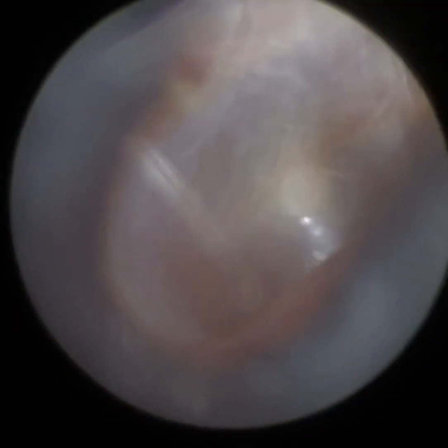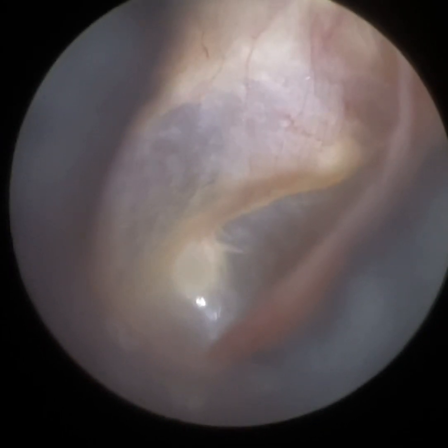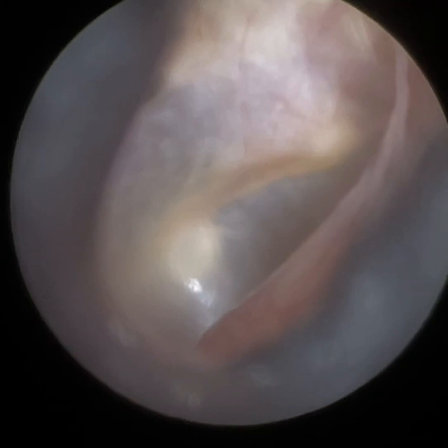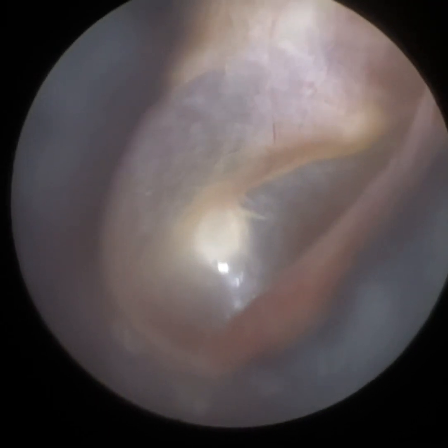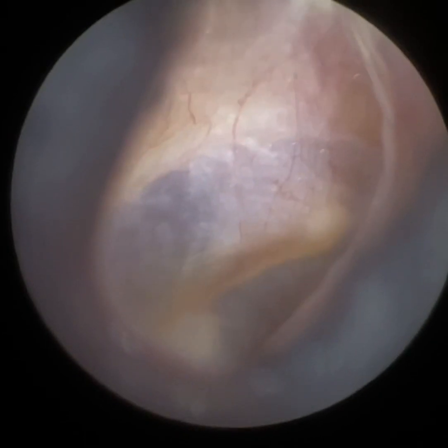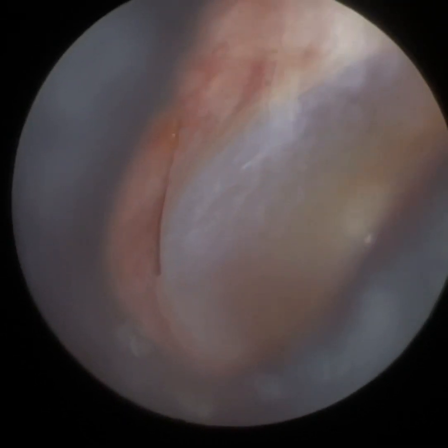I'm just going to dilate the ear canal now using the speculum. We're going to visualize the eardrum — just going to get it in focus. You can see a nice healthy eardrum there. Just having a good examination of the whole ear.